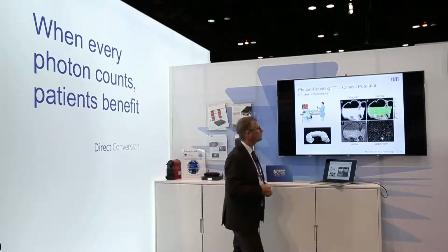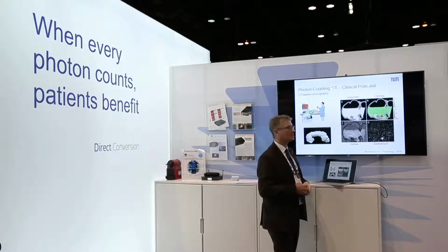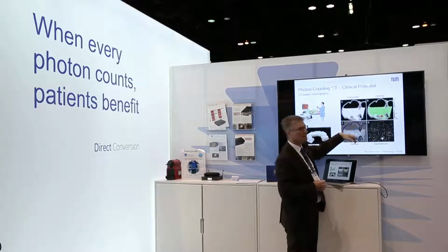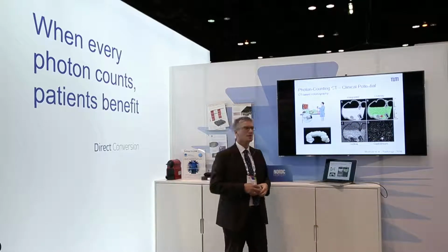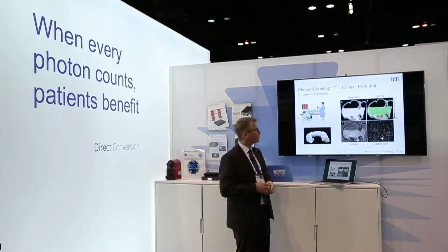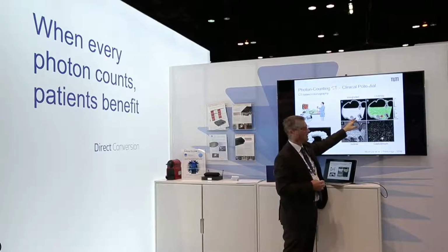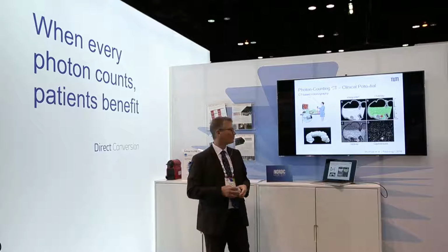Now the question is, if you take that out, if you see some polyps here on the side, and these are mimicked in a phantom experiment here with a polyp that is contrast enhancing, or some that is not contrast enhancing. The ones that are not contrast enhancing would just be cysts that are not pathologic, so they can stay in there. But if you would see something that is also enhancing after an IV injection of contrast agent, that would be a problem.